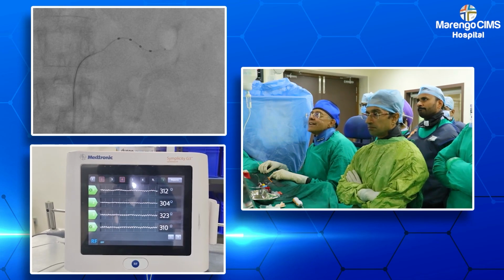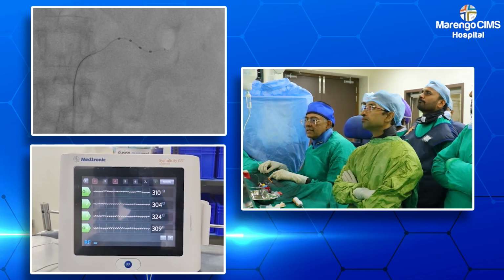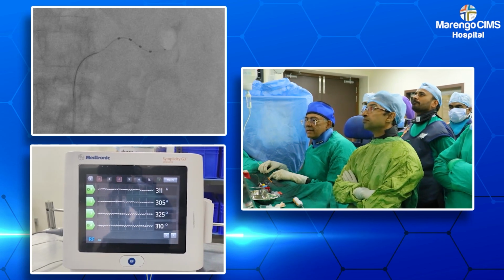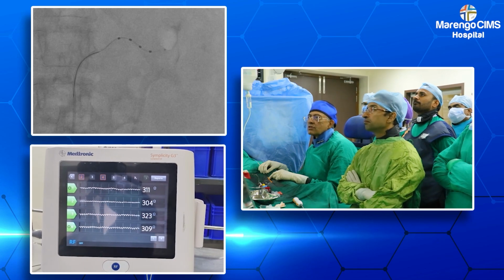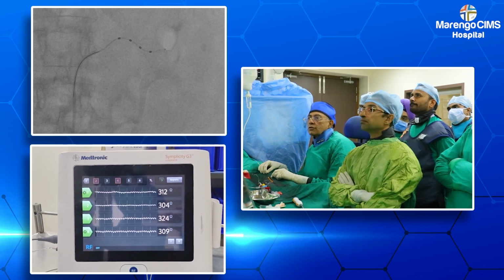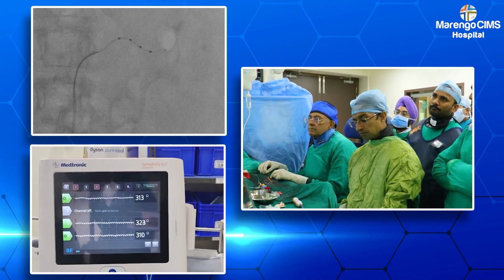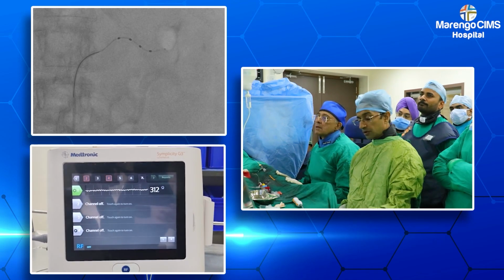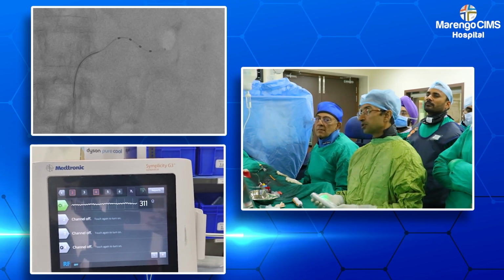The second branch we may ablate the proximal segment, but what we are doing now is we are ablating in the main renal artery between the 2 branches using a single distal most electrode. The electrode is well placed, impedance is good, so Dr. Vipul Kapoor will go ahead and ablate that. So I'm switching off the second, third and fourth electrodes, and we are just ablating the first channel, which is the distal most electrode.